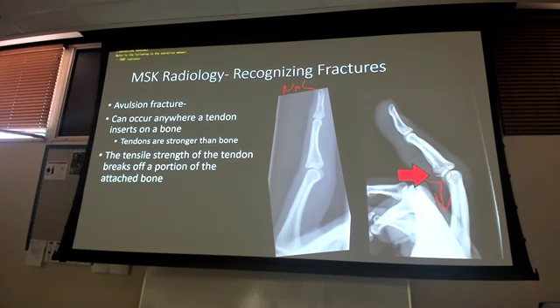The easiest way to tell is, is it a tendon insertion point? That's where anatomy comes into play, right? If I have something like my mid tibia, there's no major tendon that attaches there, but in the hands, there's a lot of those. So we see it more commonly in the hands, sometimes the feet. We'll see bigger ones, sometimes down in the os calcis with the Achilles tendon that goes in there. You can see an avulsion fracture, it just depends on the injury.